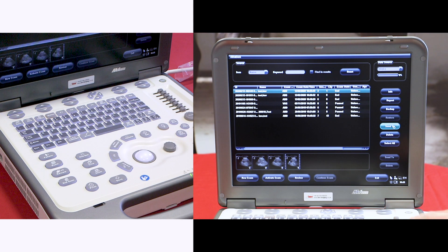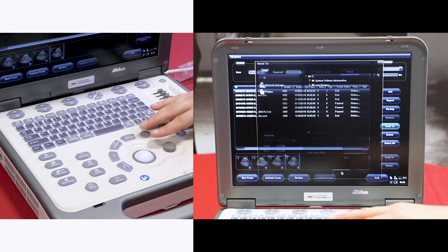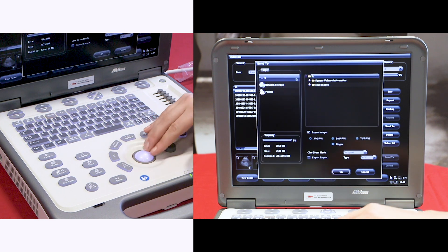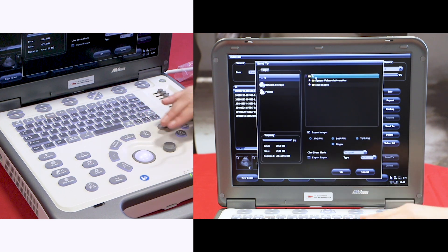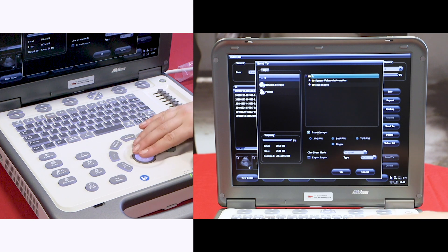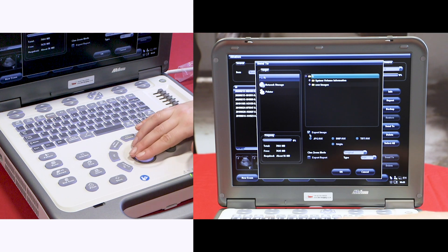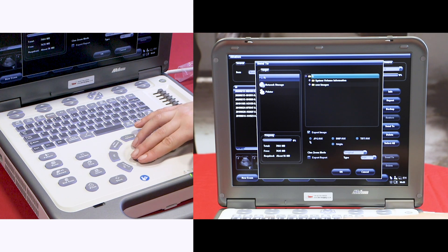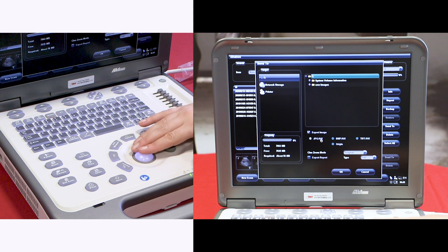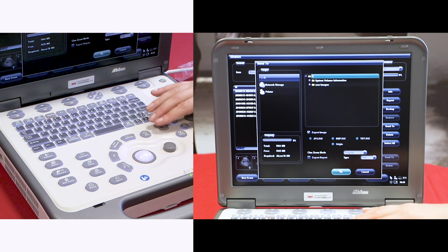Highlighting the exam and moving over to send to. Find your stick and tick for export images as JPEGs and AVIs. Press OK.